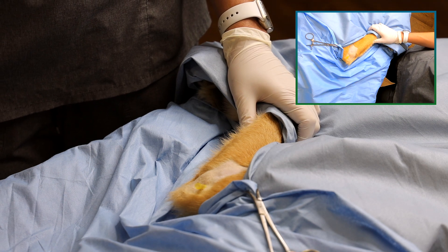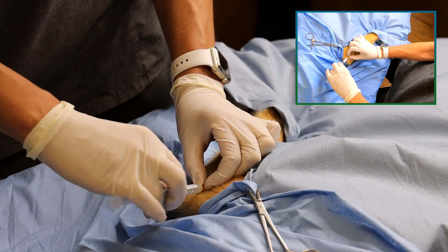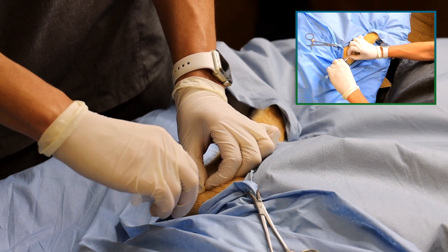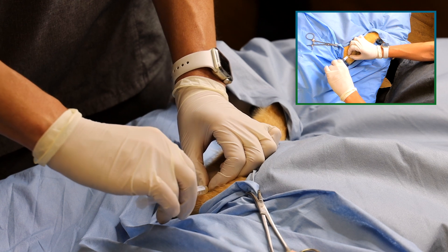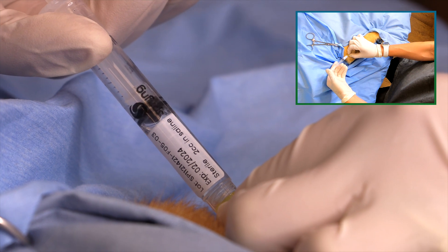If joint fluid is excessive, you may want to withdraw the excess prior to injection of your product to maximize comfort of your patient. Make sure you use a luer lock syringe to prevent losing the connection to the needle during your injection.